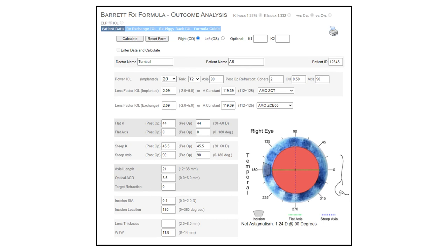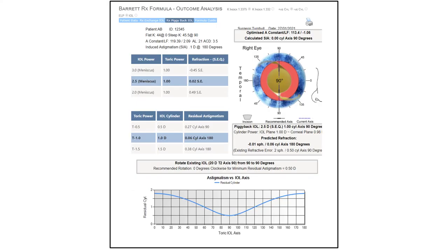This is the Barrett RX calculator available on the APACRS website. In this hypothetical case, a 20-diopter T2 toric was implanted and the post-op refraction was plus two with half a diopter of cylinder at 90. We input the pre-op and post-op Ks — which are the same here to keep things simple — and all the other required biometric parameters. The output recommends a 2.5-diopter piggyback lens for a target of emmetropia. It also shows what would happen if you rotated the primary in-the-bag toric lens, and in this case the calculator tells you it's already in the optimum position, so there's no value in trying to rotate it.